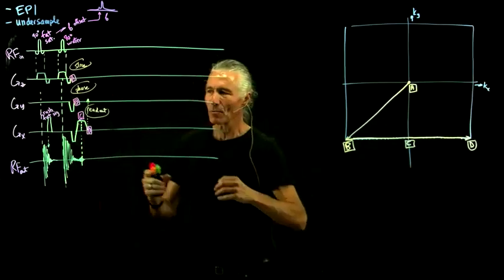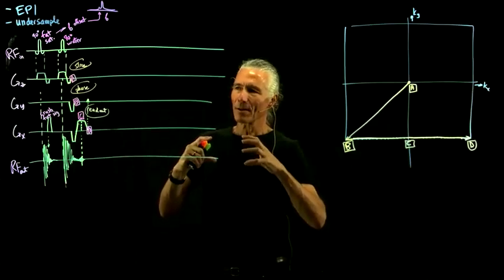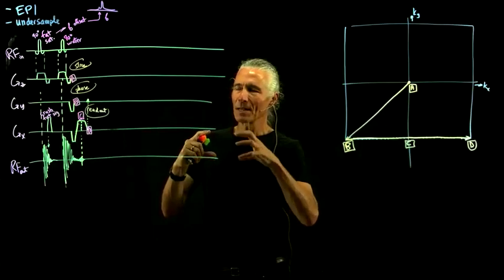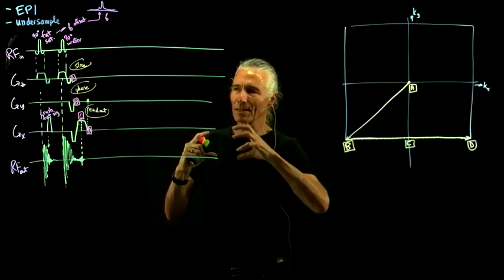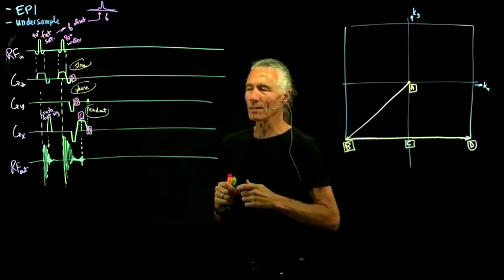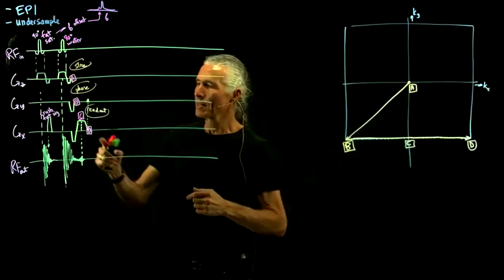That's a really big current going into the gradient coil. The gradient coil generates a magnetic field, and that field reacts with the B0 field and causes the gradient coil to wobble back and forth. That's what actually makes the noise, the high-pitched beep that you hear.